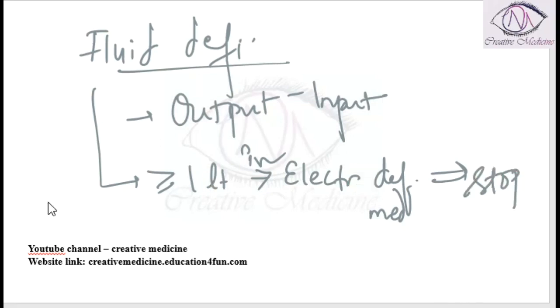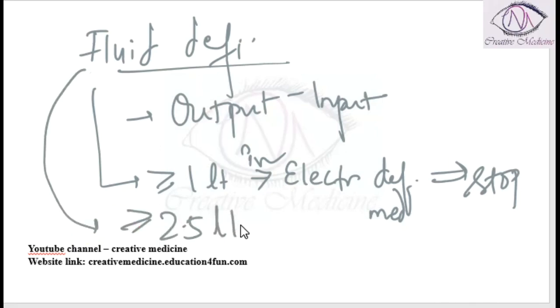If the deficit is found to be more than or equal to 2.5 liters in electrolyte rich medium, then we should stop the procedure.